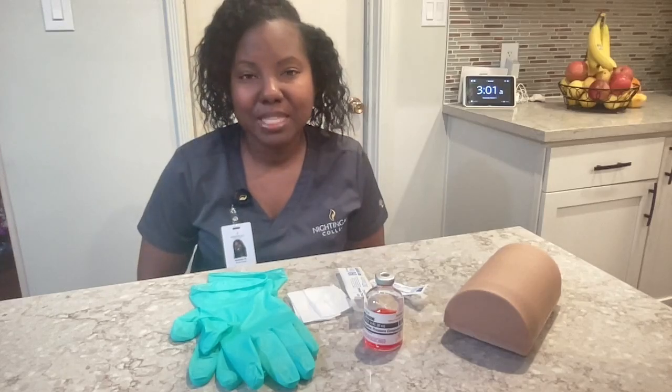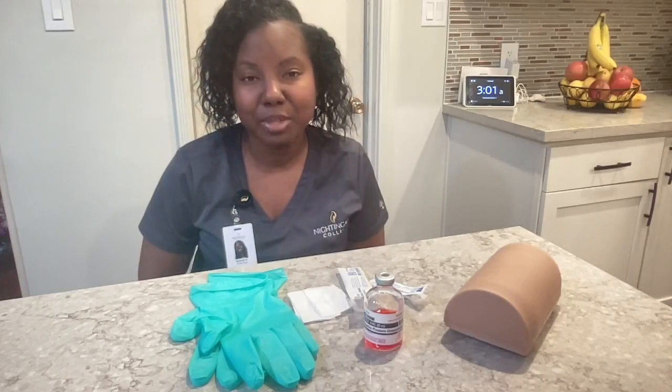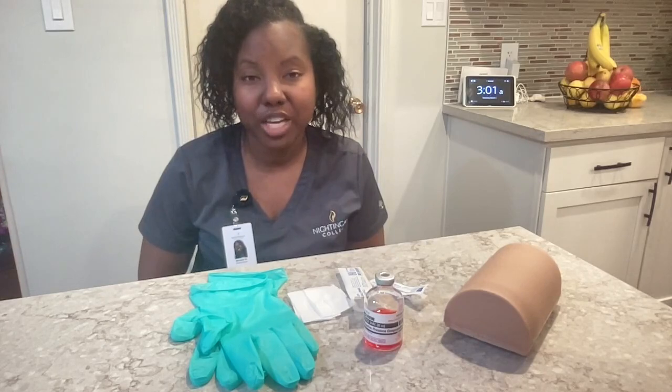Hello, my name is Michelle Nguyen. Today I will be demonstrating the intramuscular injection.